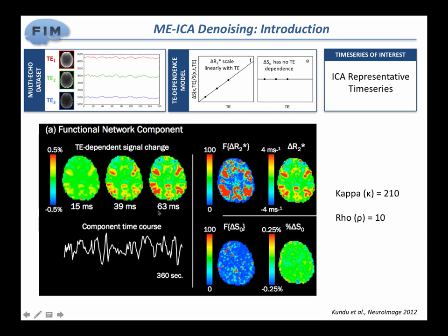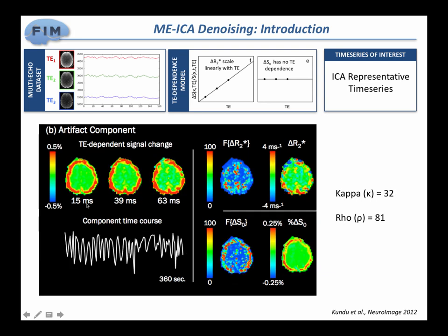It's BOLD-like. It's good news because when we look at the spatial maps of how this signal appears, they resemble some resting state network. You know, it's mostly constrained to gray matter. So it looks good. It seems to make sense.